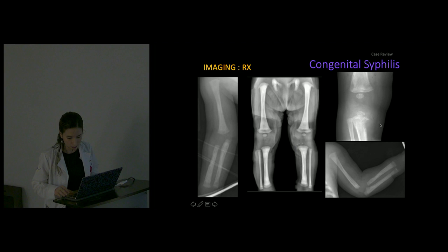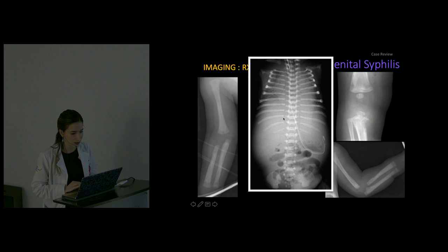In the chest and abdomen, we can see that this is another finding that we don't see very frequently because of the treatment we now have. But alba pneumonia is clinically manifested by a complete opacification of both hemithorax.